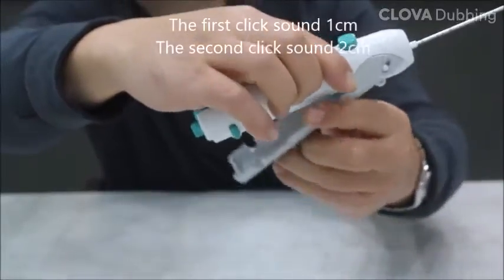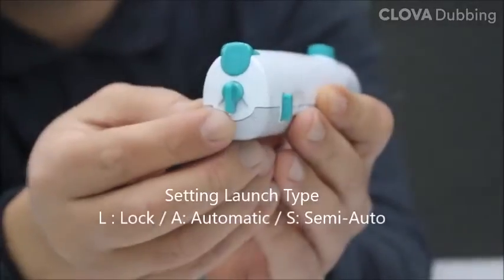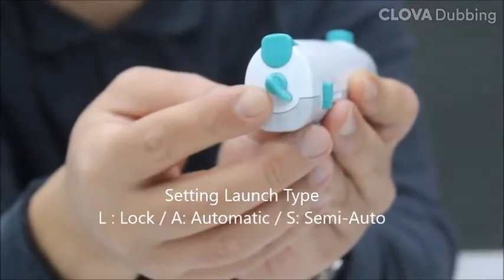After loading the device, set the launch type. S-Biopsy Orto has three types of launch: L means locking function, S means semi-auto, and A means automatic.